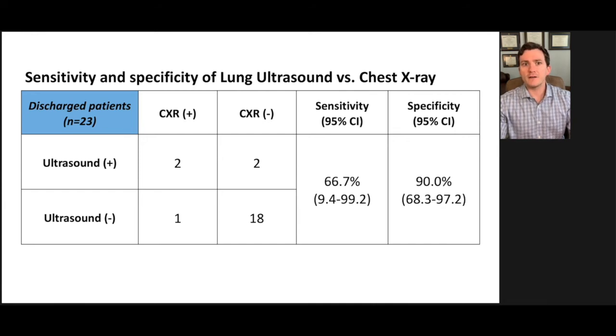With regards to novice performance in this category, only 1 patient was identified on expert review where the ultrasound trainee missed pulmonary edema on ultrasound, who was discharged with mild perihilar edema on chest x-ray. However, this patient was doing well at follow-up without any adverse events.